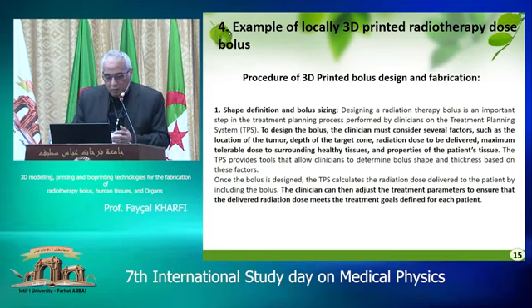The procedure that we developed to fabricate such a bolus with 3D printing has two phases.